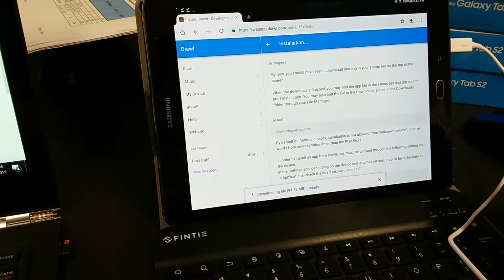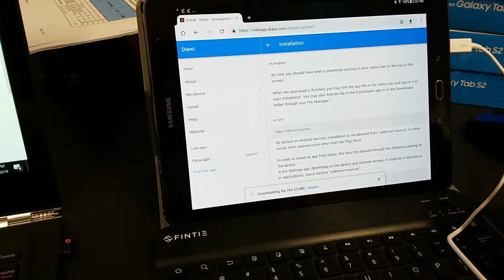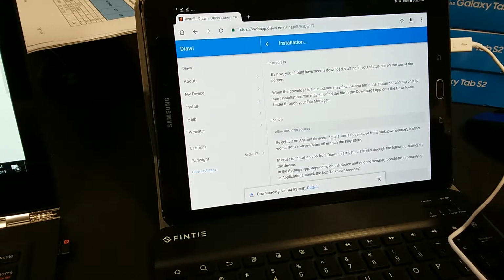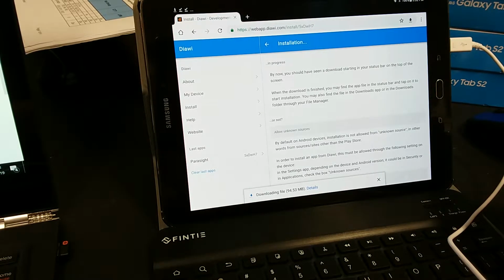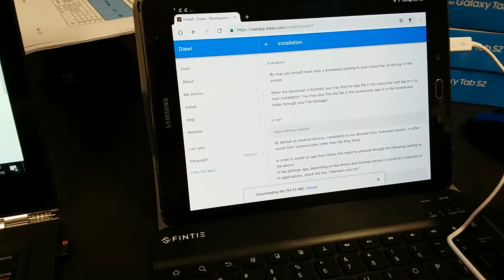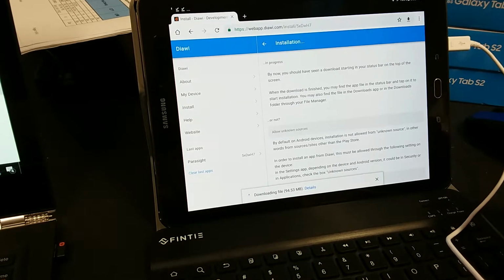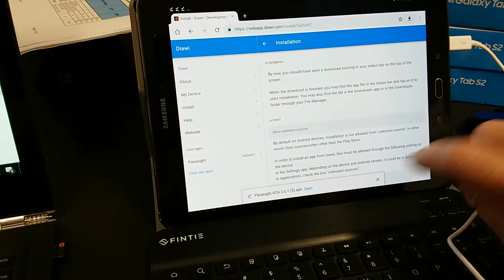The new build is pretty exciting. We now have full support for fecal egg count reduction tests, so you'll be able to display those side by side. If you run a fecal egg count today that's positive and you treat, and you run another fecal egg count test in the next 10 to 21 days, it will pull it down from the cloud and give you a side by side. So this enables cloud support, which has been a much requested feature, and it speeds up a few things for you. So we hope you'll appreciate that.